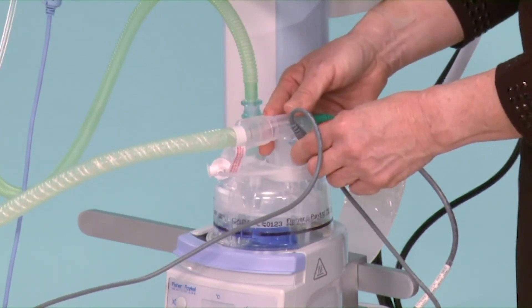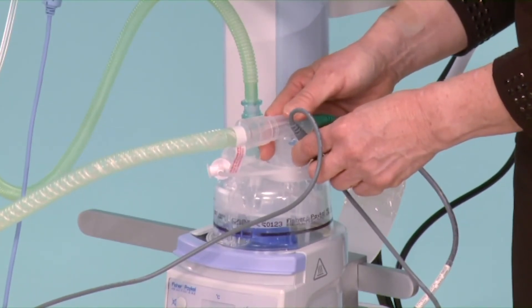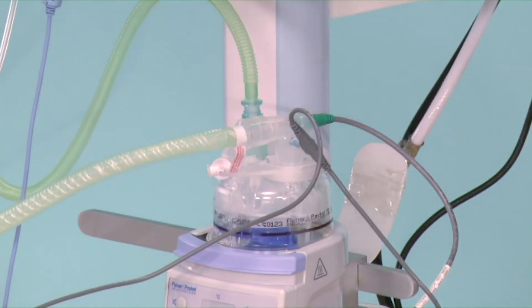Although you may have a slight loss of recruitment, it is much better than disconnecting the whole assembly to get rid of the water.